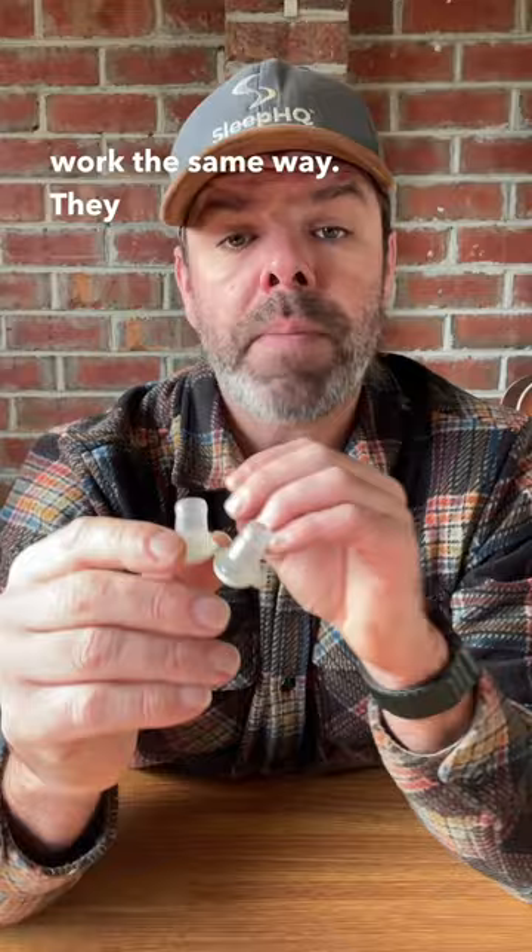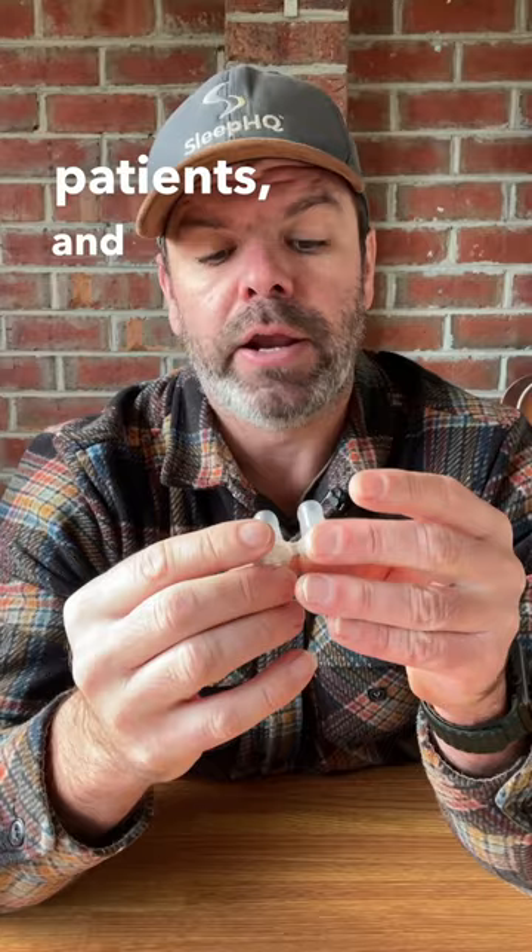Now the way it works — all these devices work the same way. They make it harder for you to exhale, to breathe out, and that creates back pressure which reduces airway collapse. Now it's suitable for mild to moderate apnea patients and also heavy snorers.